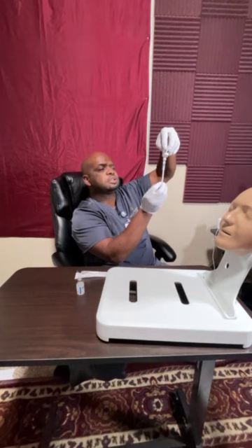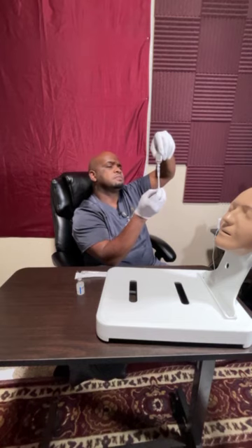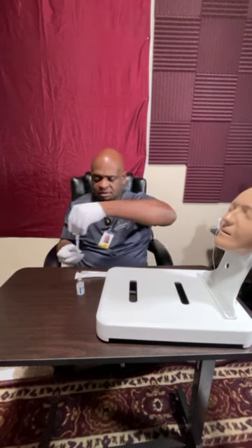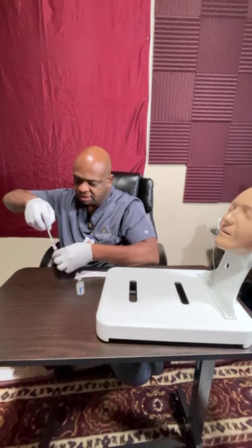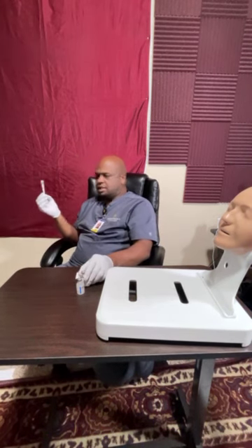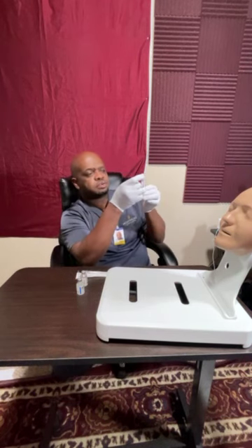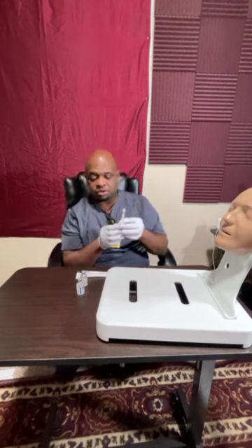Let's make sure I'm at the right spot. Okay, it is 4 units. All right. And we're going to let the nurse verify. She verified that there's 4 units. If there's any air, we're just going to tap. There's no air bubbles in that one, which is good.